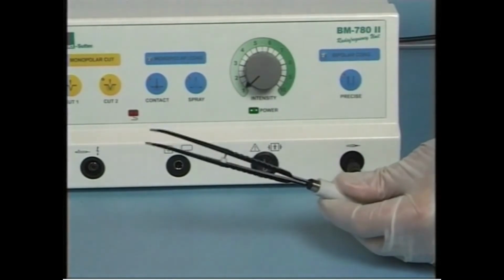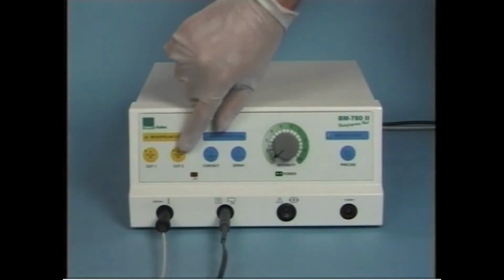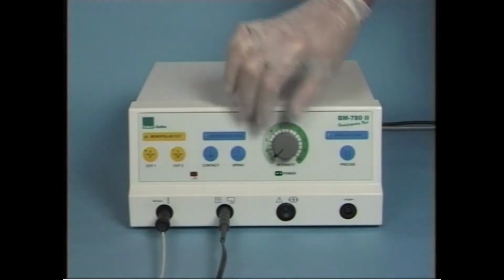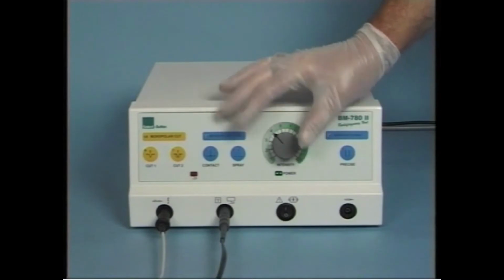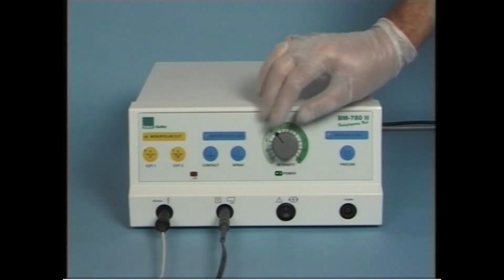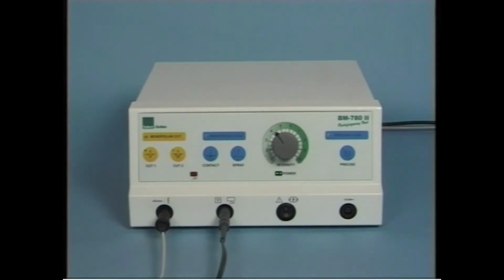Select the desired operating mode and power setting. The generator provides 4 monopolar operating options, cut 1 and cut 2, as well as contact coagulation and spray coagulation, plus 1 bipolar application. More detailed information is contained in the printed operating instructions. The generator is now ready for use.